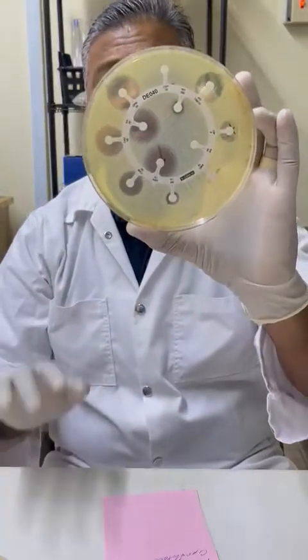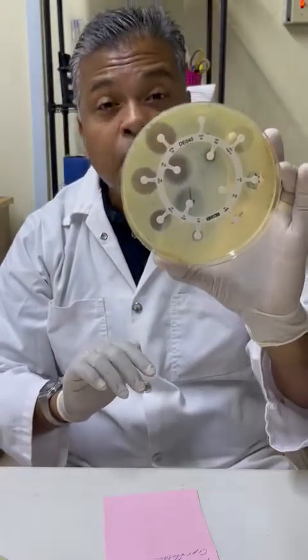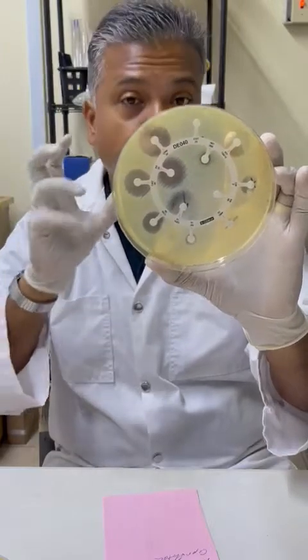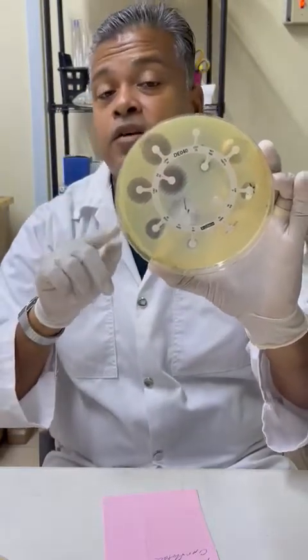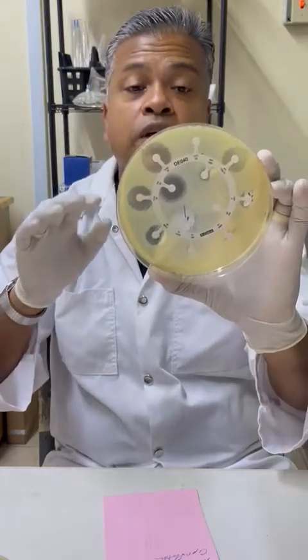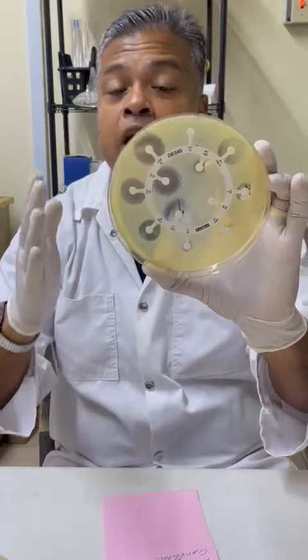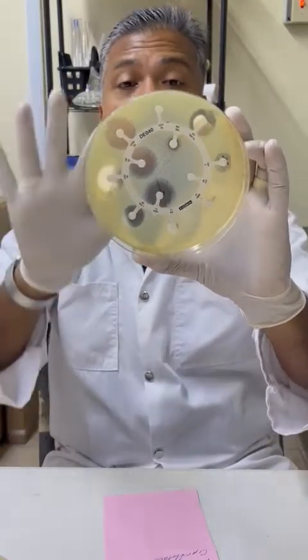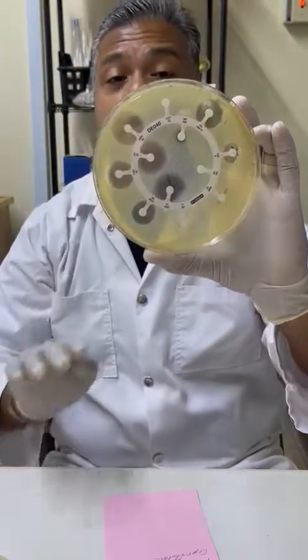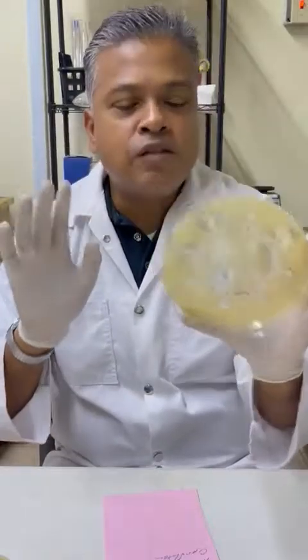What you are seeing on this plate, the clear zones are zones of inhibition, meaning that antibiotic prevented the organism from growing. So that is what we will tell the doctor to use. In a report, we will say, Doc, okay, sensitive to cefepime, sensitive to ceftazidime, sensitive to nalidixic acid, but not these that are resistant. This will be listed as resistant. But this is not the message this morning.